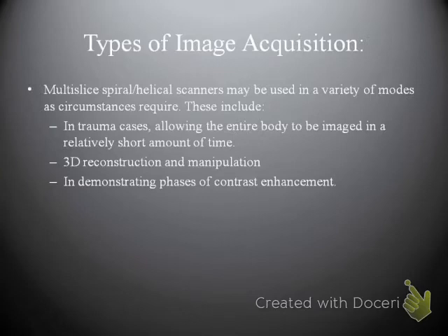And so we all know, we've all been in these trauma situations where you have to get the scan performed rapidly. And once you get the scan performed rapidly, you have to get it reconned. You have to do all of these manipulative techniques to the image. And so multi-slice has really helped us out in that we can get the patient in and out of the CT suite very rapidly, get them on into something else.